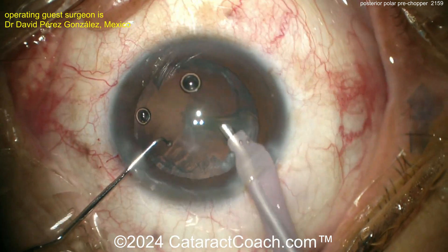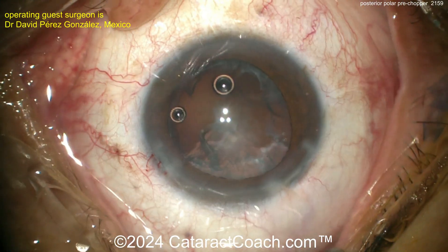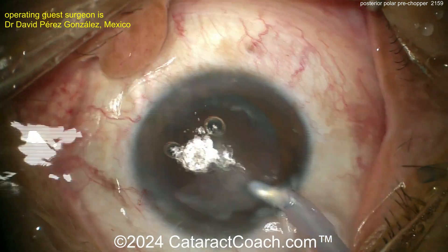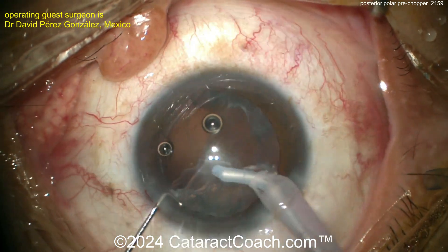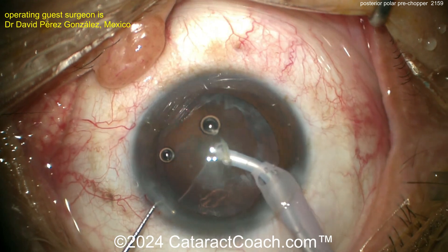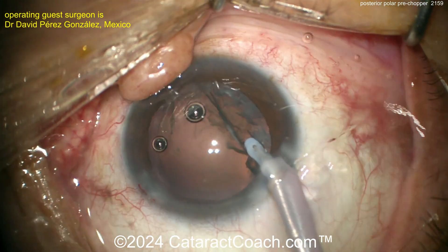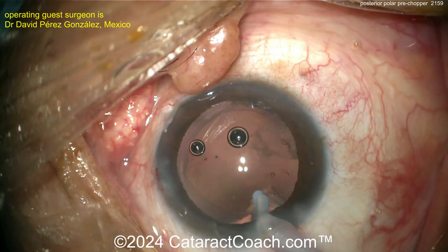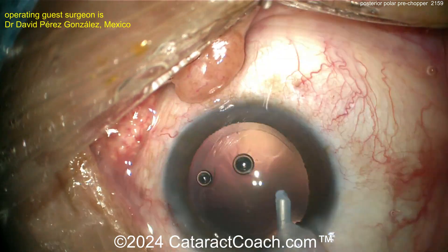At this point you may want to switch to the IA probe, or try visco-dissection, which can be very helpful. Get out all the cortex other than the posterior polar opacity first — save that area for last. Don't go crazy polishing; oftentimes it'll come up and be released on its own. Get the peripheral cortex at the capsular bag equator first, and then that posterior opacity usually just comes off by itself.